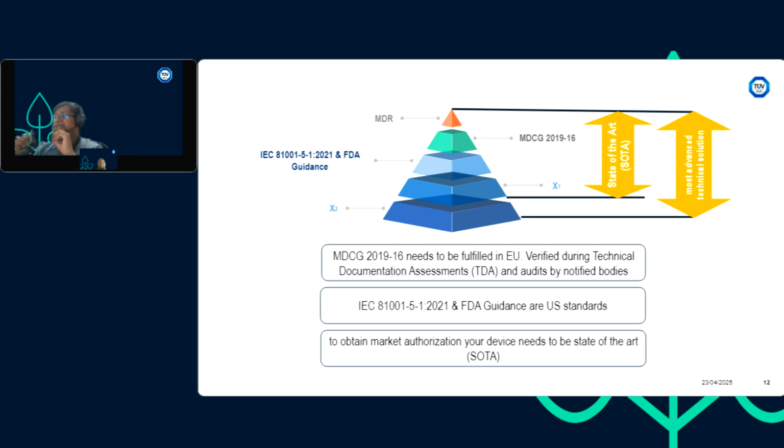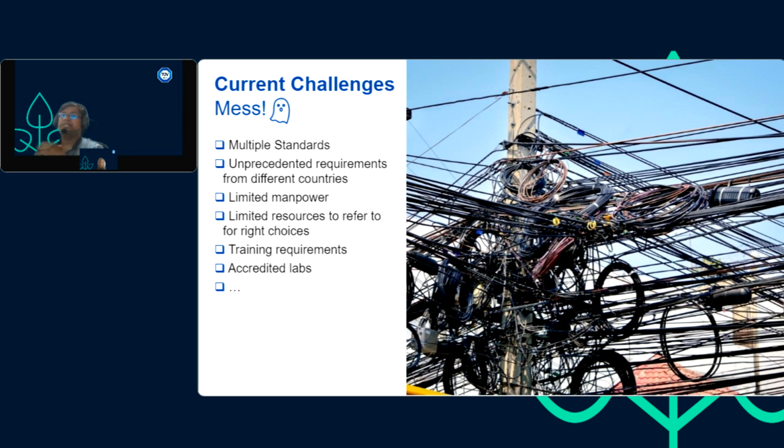So irrespective of whether your device is getting into further actions, if your device is getting updated, if its functionality is getting updated, you still need to do the testing irrespective. So this is one of the key points to know here. Now every one of us understands these things. What is the challenge, why are we not able to do it?